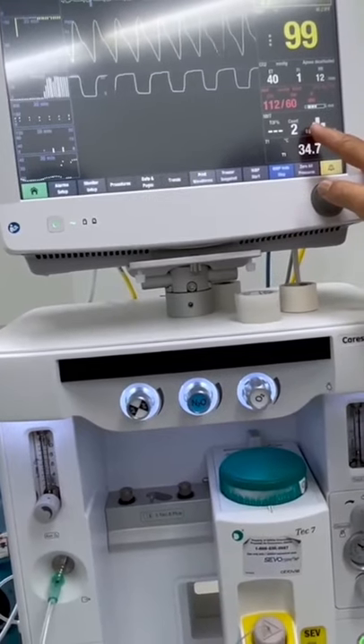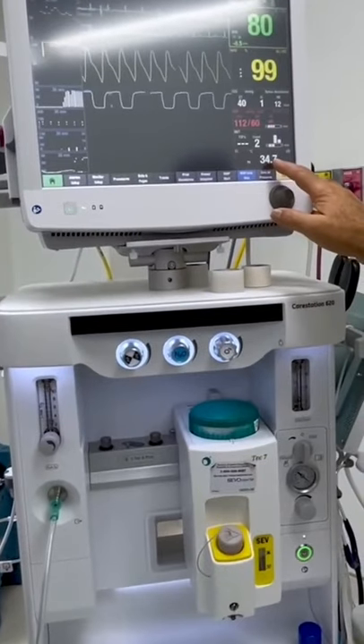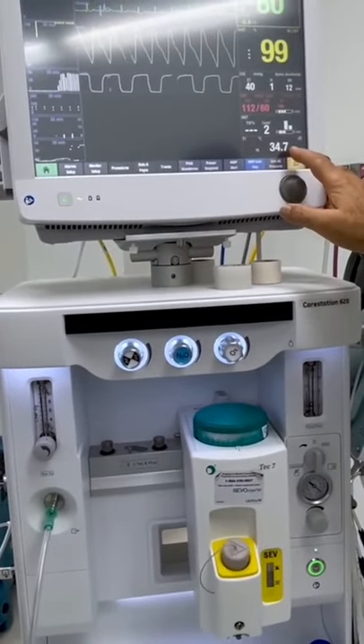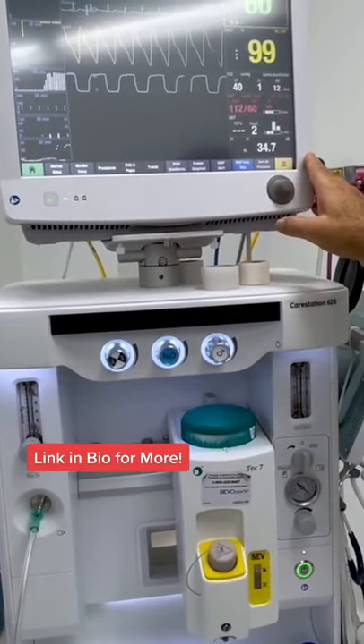We also monitor muscle function during the surgery. This is the temperature that we use when we're doing long cases. Right now her oral temperature is less than 35. We have a warming blanket on her, so hopefully this will come back up to about over 36 in the next two, three hours.